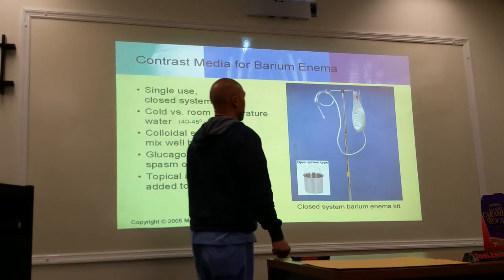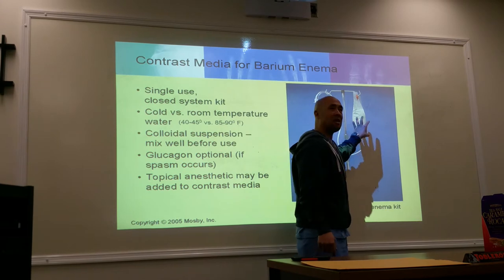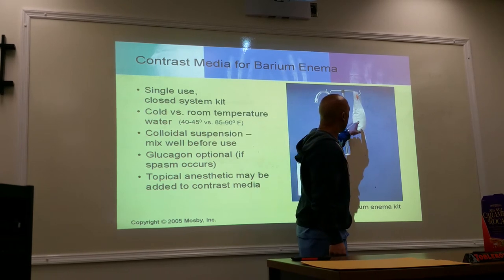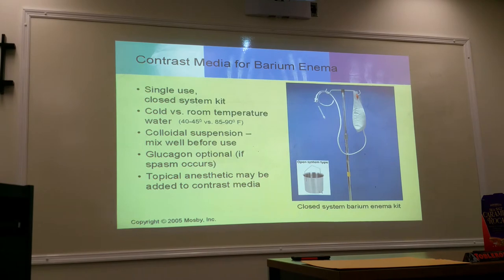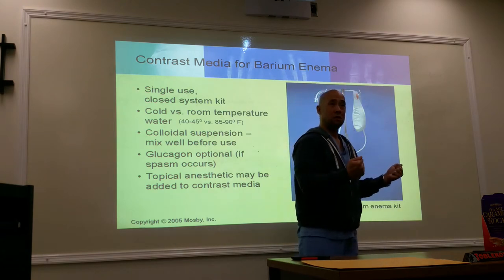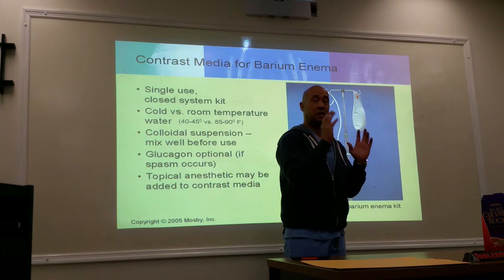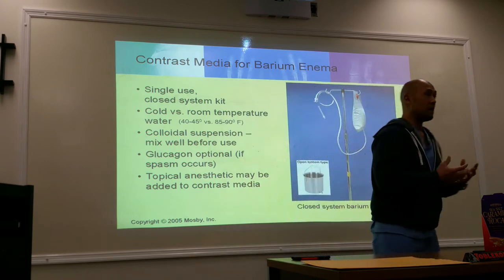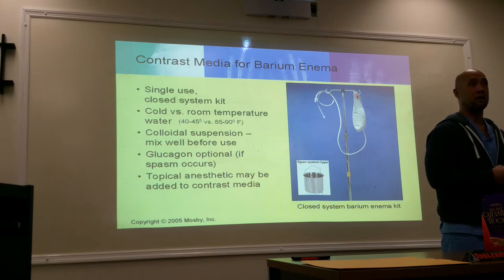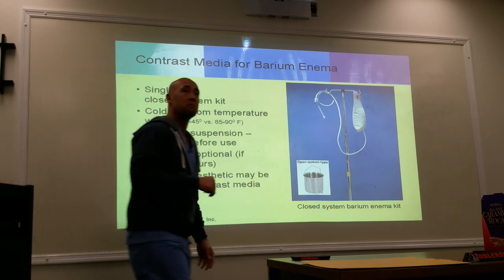Now, this is real cool. In some of the barium enema kits that you get, it's going to have the barium in powder form already within the bag. So all you've got to do is open up the bag, put water in there, and shake it up. And here you have the control of adding your own water. So you can make the consistency of the barium thin, or you can make it thick. And that's, again, whatever the practice is at your hospital. Most places use a thicker type of barium to do barium enemas because it has a tendency to stick better on the walls, in the lining. Use tap water, though? Just tap water.